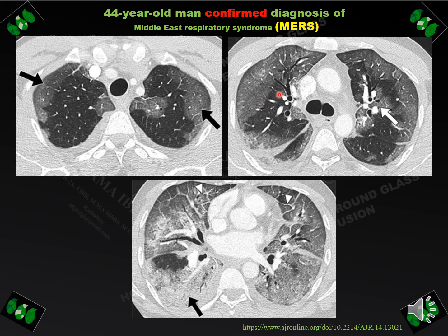This patient with MERS shows multifocal areas of ground glass opacity in a subpleural distribution, with lower lobe consolidation. We can differentiate consolidation from ground glass opacity by the obscuring of blood vessels through the high attenuation opacity area, comparing with blood vessels that can still be discriminated through the opacity — that is ground glass opacity. Both are high attenuation areas compared to normal low attenuation.